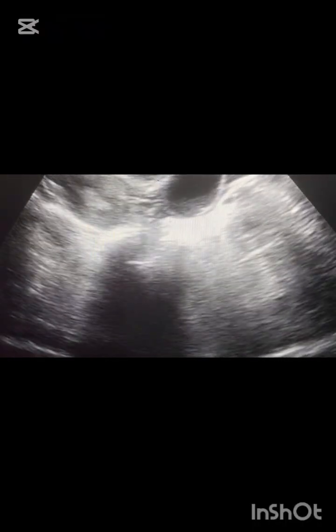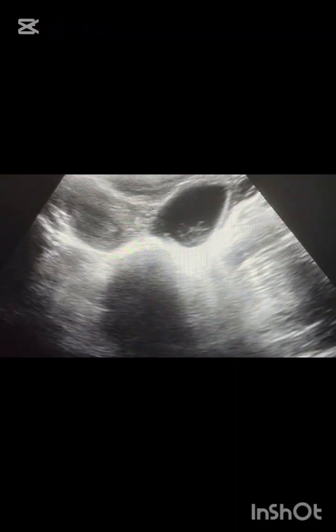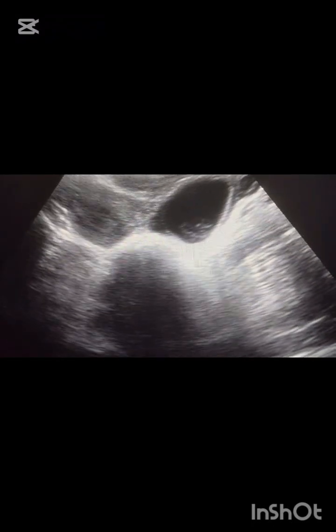When we want to rule out any pathology regarding the pelvis, a transabdominal ultrasound for the pelvis is performed with a full bladder. So if you want a good ultrasound and you want to rule out any pathology, always go with a full bladder for transabdominal ultrasound. When the doctor advises a transvaginal ultrasound, TVS, always go with an empty bladder.